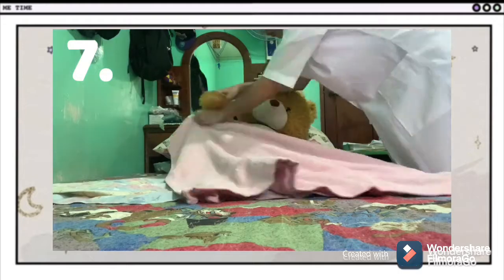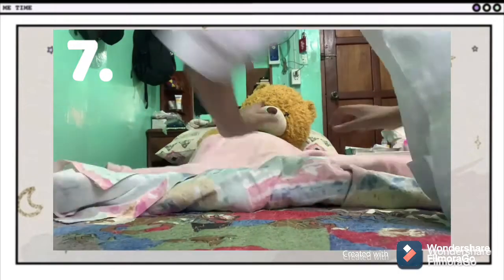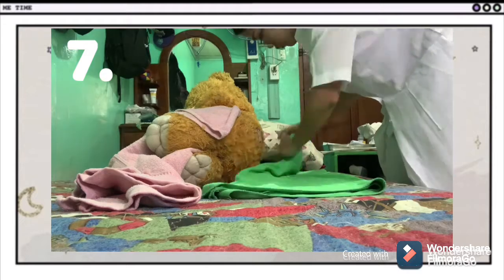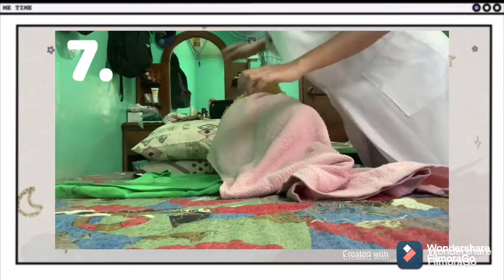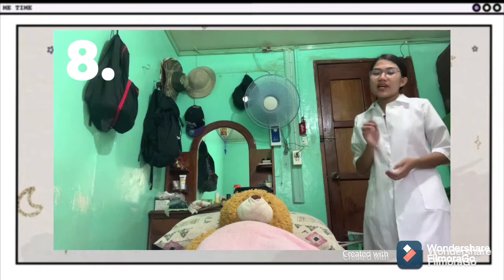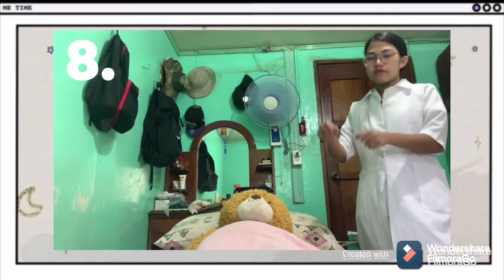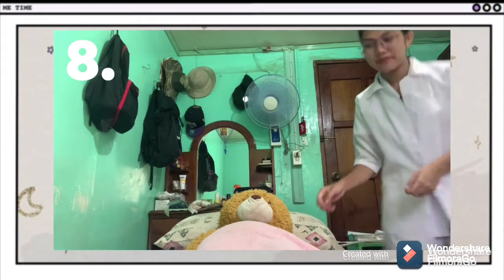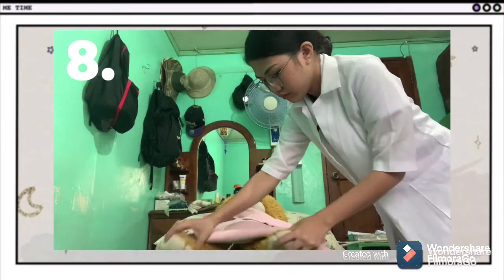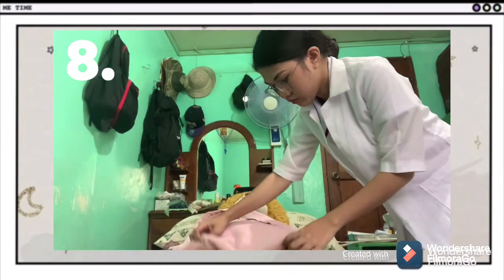Replace the top sheet with a bath blanket. Place a waterproof underpad under the client. These protect the bed linen from moisture and from getting soiled. Place the client in supine position with feet upward and drape the client. Good visualization of the meatus is important. Embarrassment, chilliness, and tension interfere with the introduction of the catheter.